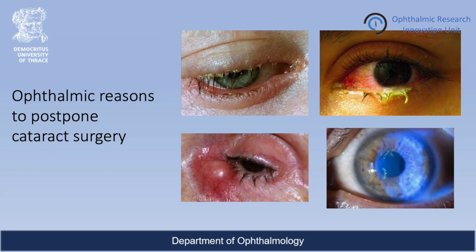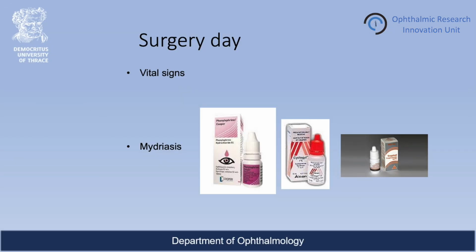Reasons to postpone surgery also include inflammation of the eye and its accessory structures, as shown in this slide. If all the above factors favor the continuation of the surgery, mydriatic drops are instilled, vitals are taken, and the procedure begins.